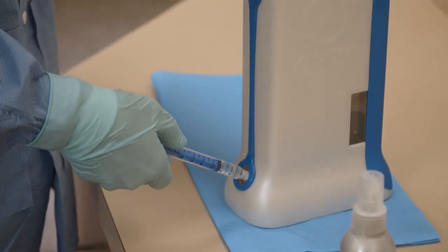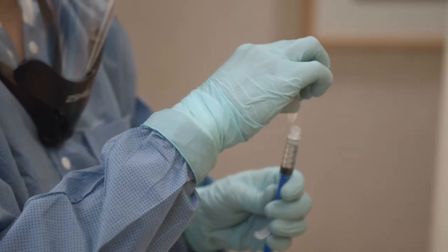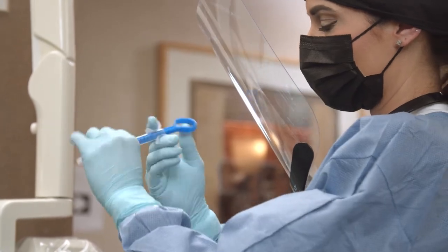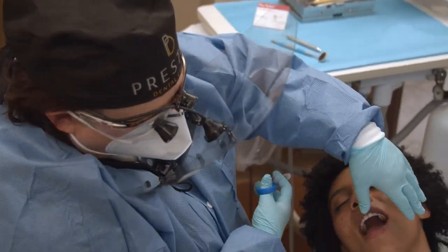But if you're using the Inutra syringe, you pull up the amount of anesthetic specifically for your patient and your treatment one time. One syringe, however many mLs you need, and it is ready to go right there. There's no changing. It streamlines your injection technique.